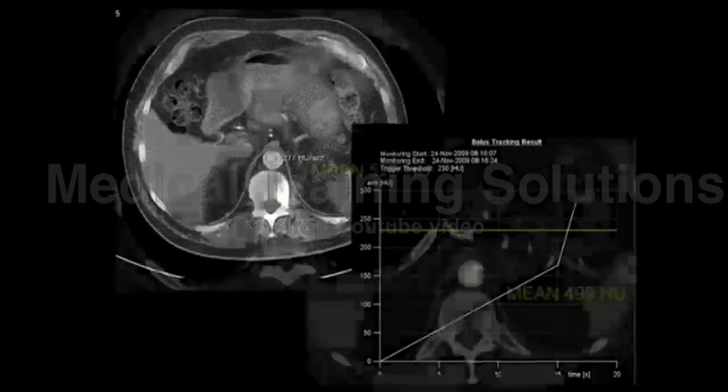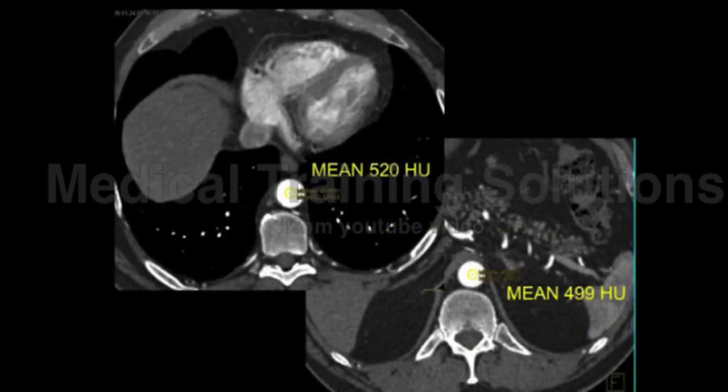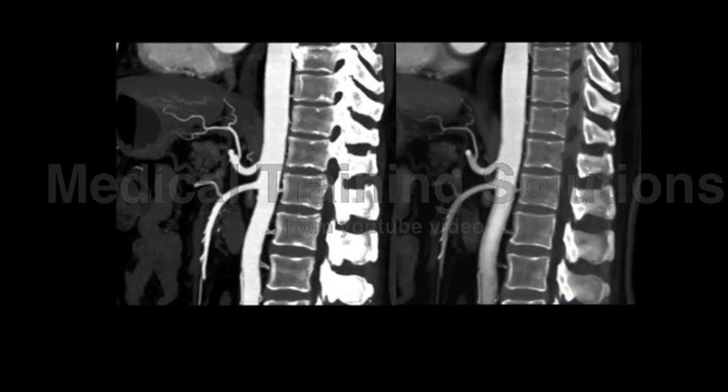but you can really optimize the enhancement, and I've shown this slide before, but you can see how you get enhancement at a 500 Hounsfield unit level, and so when you're doing 3D vascular mapping, you get really spectacular enhancement, and the enhancement is homogeneous throughout the column because when you hit a trigger point, and you scan, the scanning is so fast you don't have any of the washout.